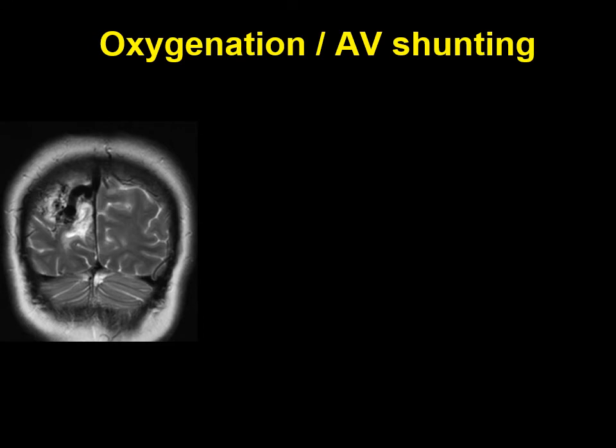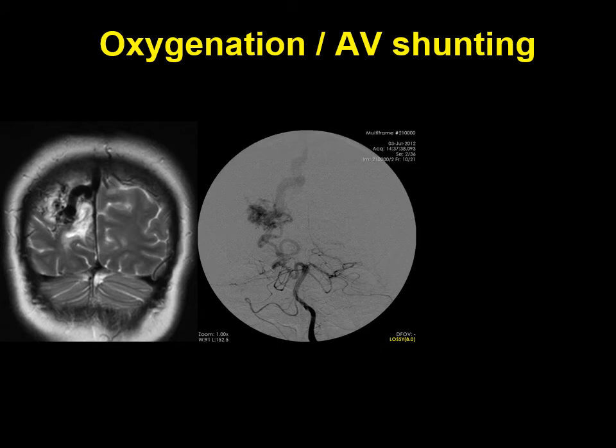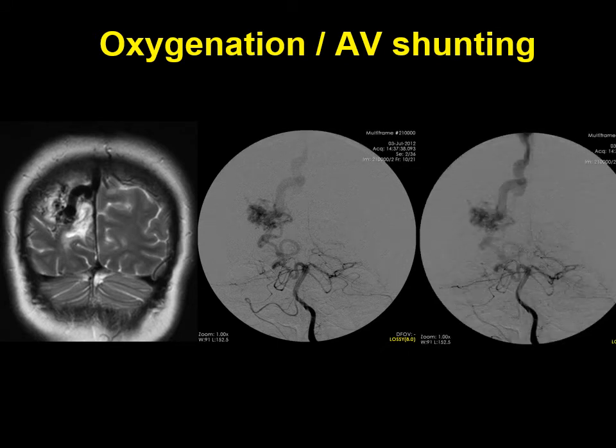And that's shown and confirmed with the subsequent images. You can see that large vein draining cephalad into the superior sagittal sinus. And you can see the same on the catheter angiogram as is illustrated here. So another potential use.